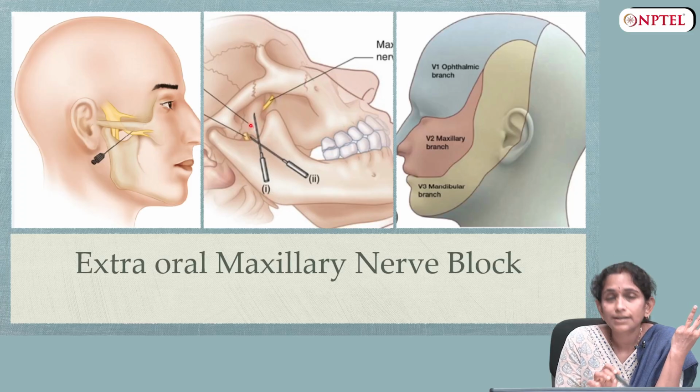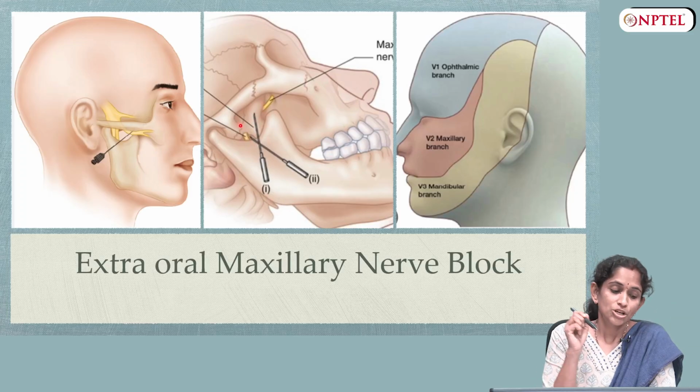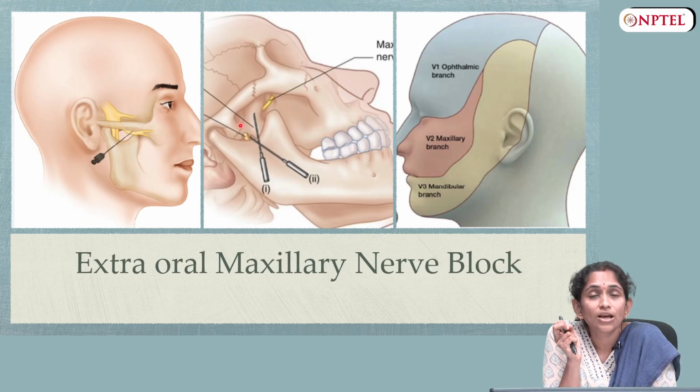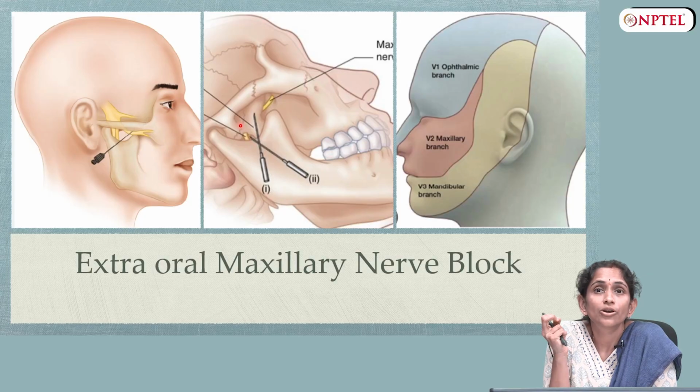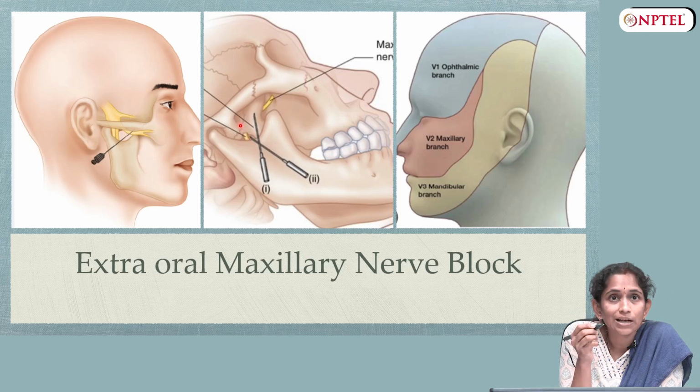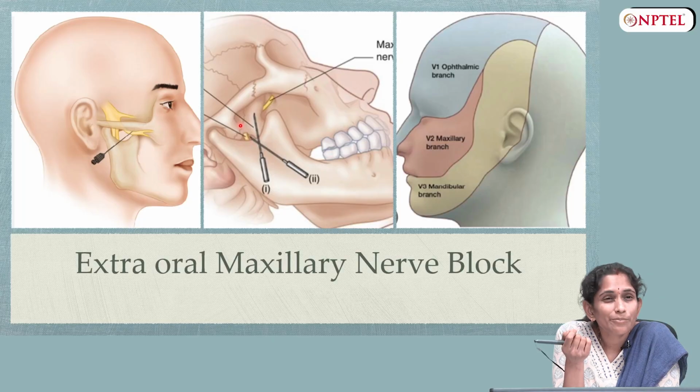That is the third landmark we have to reach. So, what needle do we use? We cannot use a short needle. We also cannot use a long needle, which is 40 millimeters, because if we insert the needle till the hub of the needle, the hub can break. So, that is the reason why we generally prefer using a spinal needle of 25 or 27 gauge.